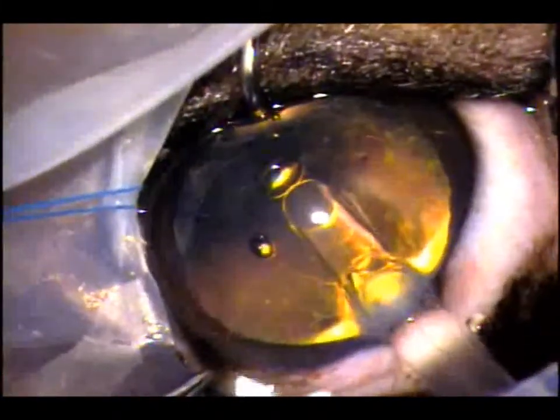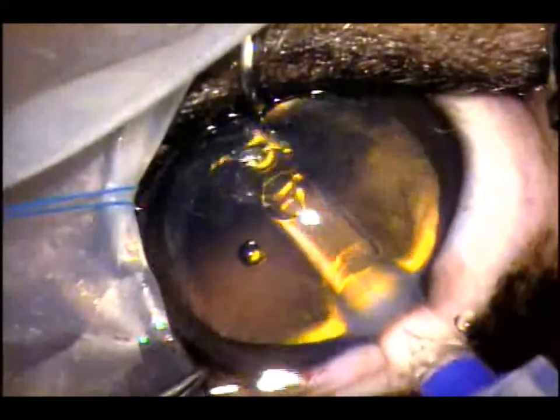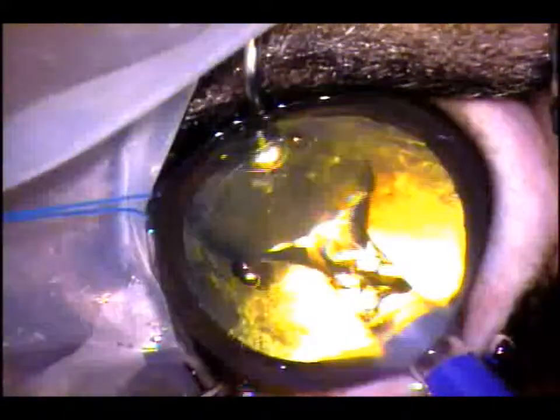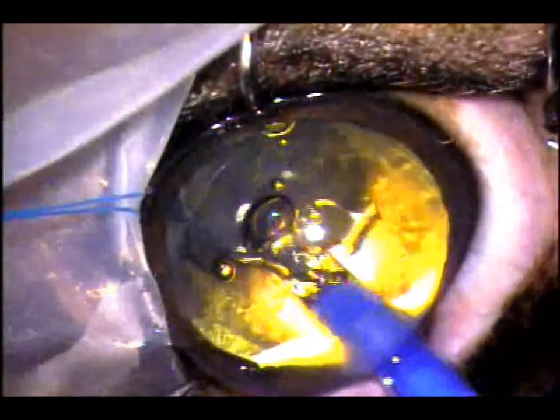The lens capsule will keep the lens stable, and in many cases, before the invention of the capsular tension ring, we would not have been able to put a lens in, leaving the dog aphakic, which would have functionally affected vision.